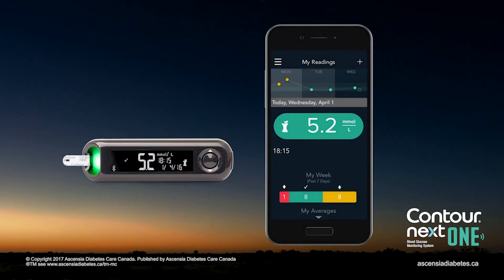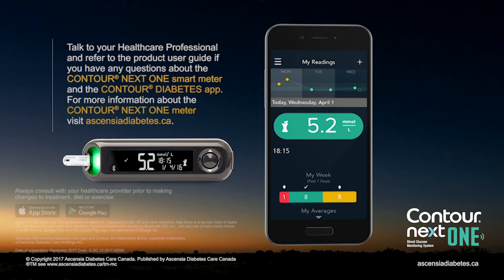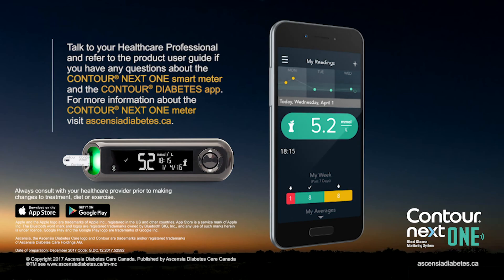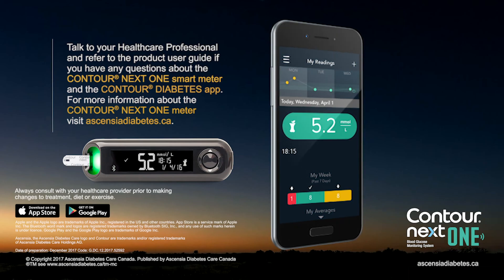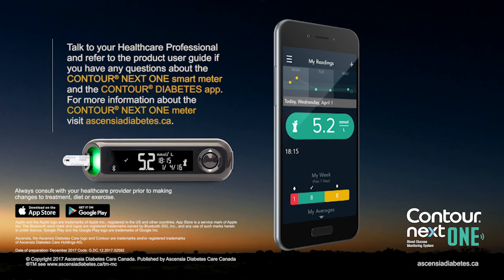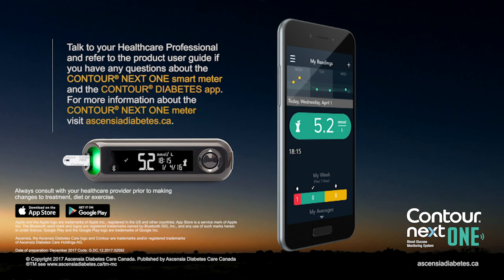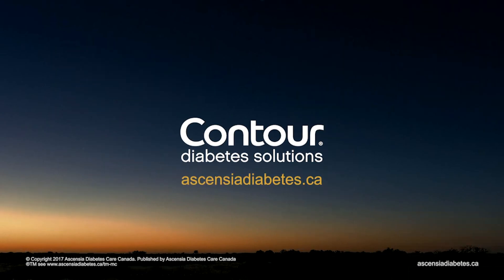The Contour Diabetes app displays your latest results on your mobile device along with information to help manage your diabetes. Talk to your healthcare professional and refer to the product user guide if you have questions about the Contour Next One Smart Meter and the Contour Diabetes app. For more information about the Contour Next One Meter, visit ascensiadiabetes.ca.